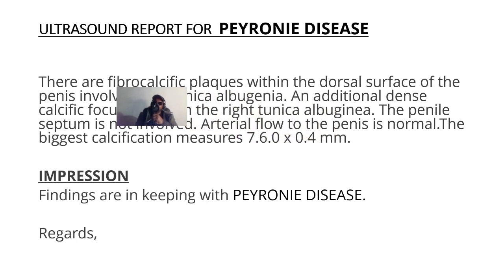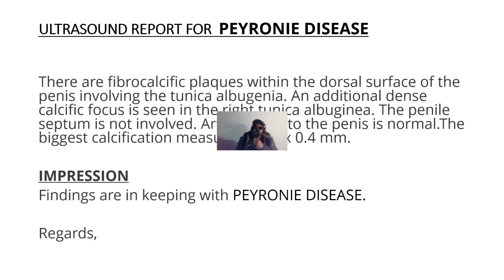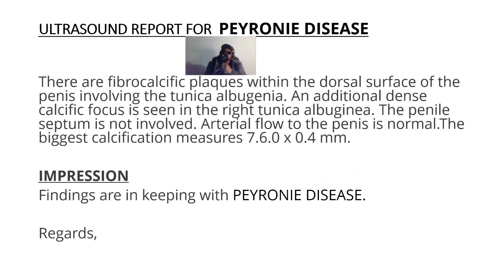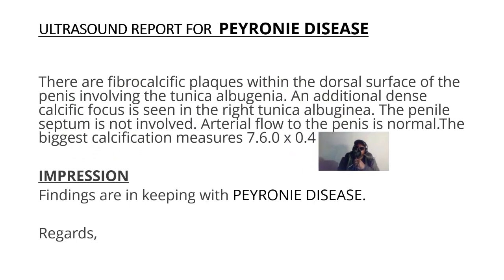You can localize the calcifications. After localizing them, then also give a measurement. This 0 is a mistake, so it's not there. So the measurement is just 7.6 millimeters by 0.4 millimeters. That's the measurement of the calcification there.